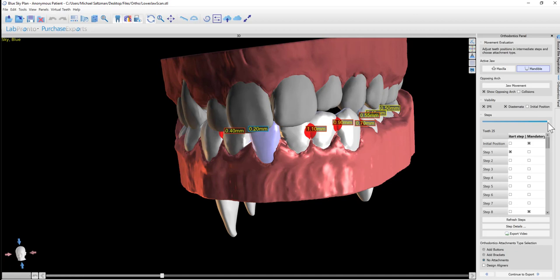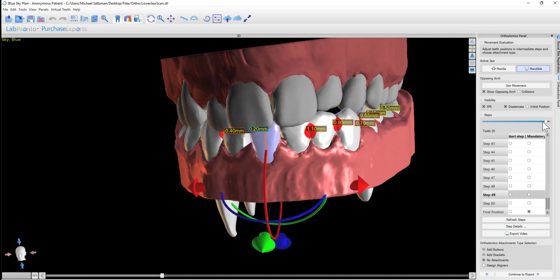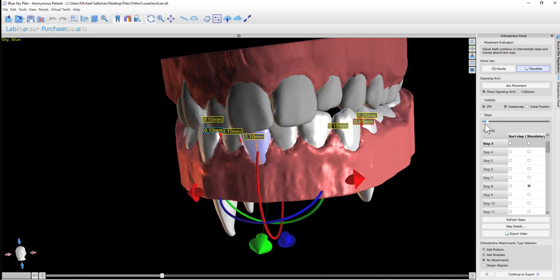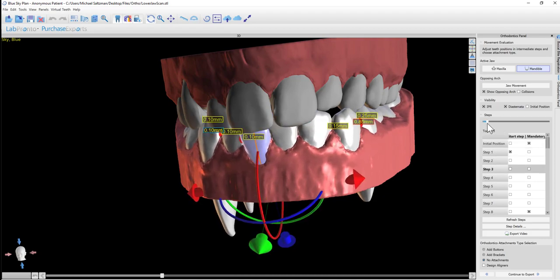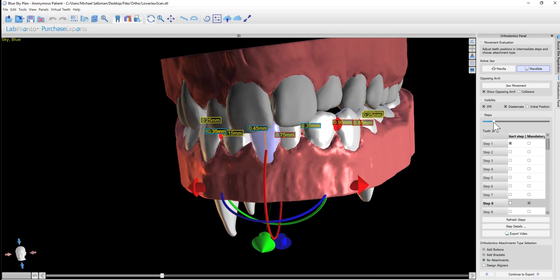What we also have here is a slider that shows us the various steps. So actually as we go through the steps, we see the teeth move at each step.